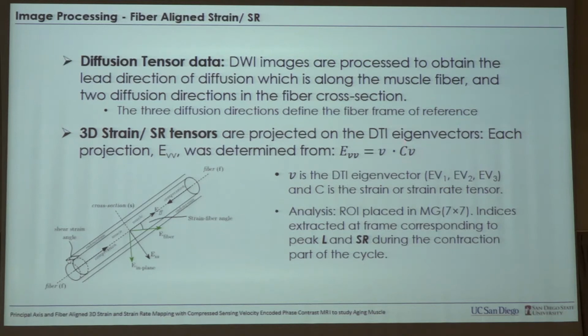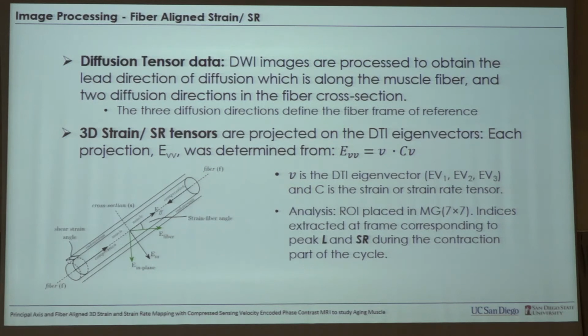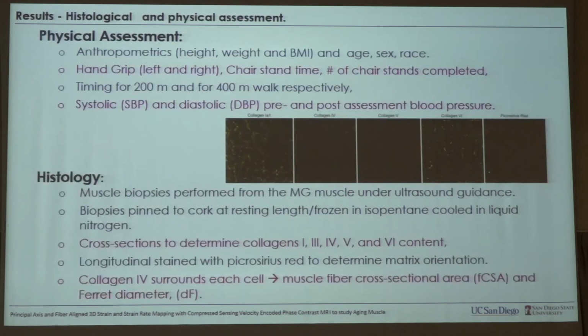We also put in, at the beginning, we had found the fiber angle or fiber track from imaging the fatty fascicles, suppressing water and just looking at the fat that separates fascicles. That was our indication of the direction of the fibers. Instead, a more scientific way of doing that would be diffusion tensor imaging. This is a very elegant technique by which you can actually literally track the fibers and their paths, and from that you know all that you almost need to know about that fiber direction.